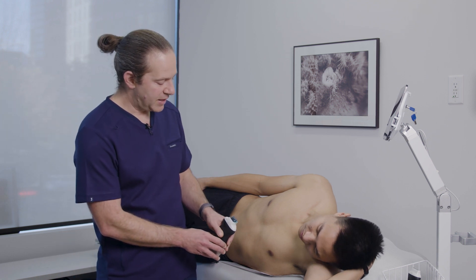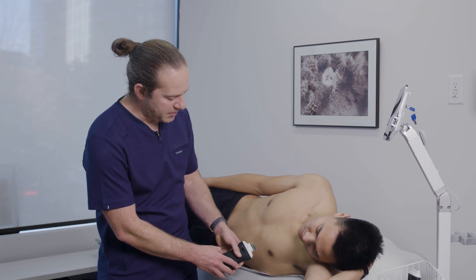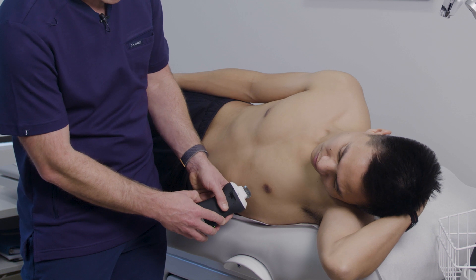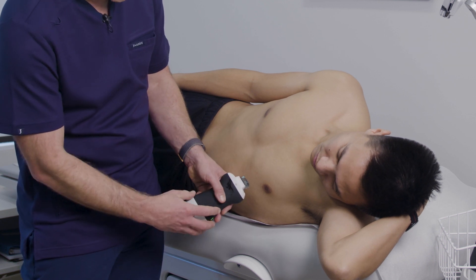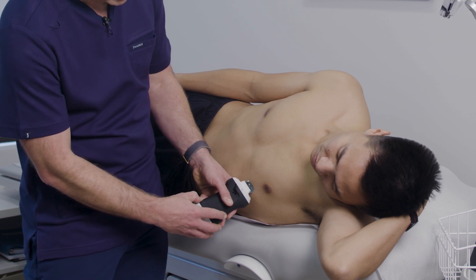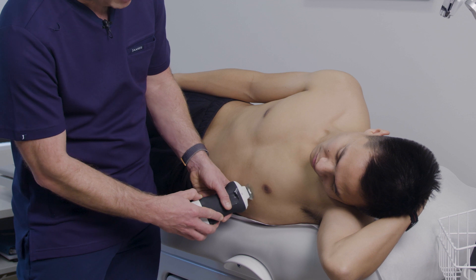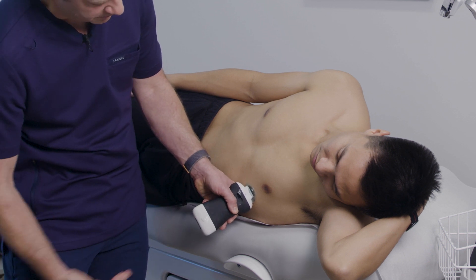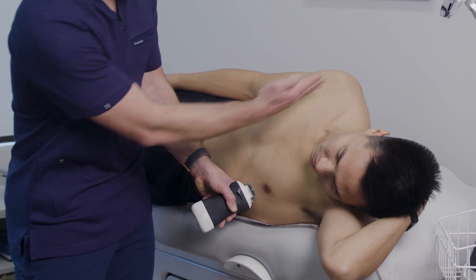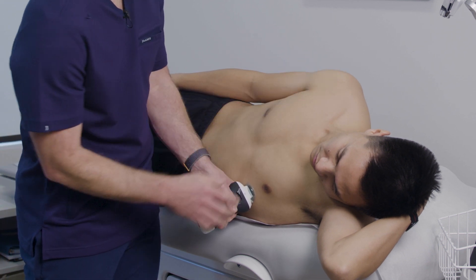To get that view, I'm using a phased array transducer here, and I'm coming in at an oblique angle, usually at about the fourth or fifth intercostal space mid-clavicular line. I like to think of it as a spear coming up from the apex of the heart towards the patient's right shoulder.